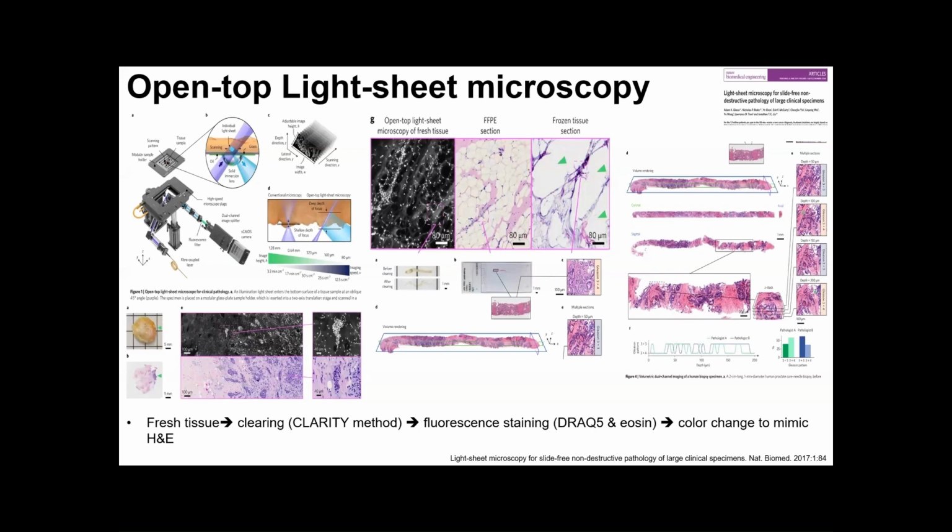Open-top light sheet microscopy is a modified technology to increase focus depth and decrease signal reflection from surface irregularity.